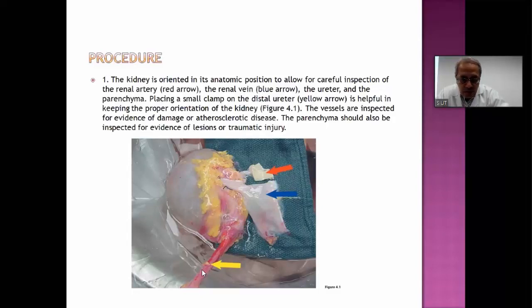If this anastomotic line is with this kind of tissue, which is fat or any tissue other than the vessel wall, then it will be the seat of thrombosis. This fat is thrombogenic. So what we don't want after we release the clamp is to have a clot or a thrombus in the space which can obstruct the blood flow. And this is the thing which has to be kept in mind very closely.